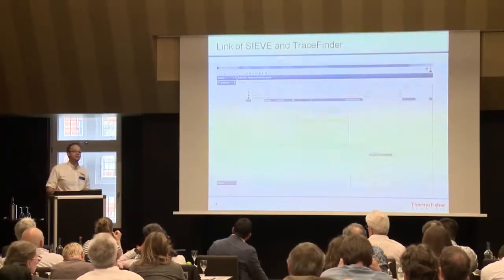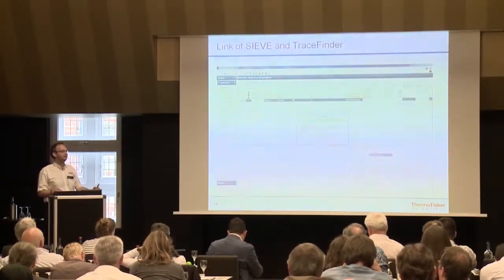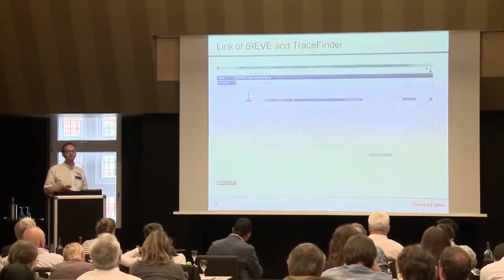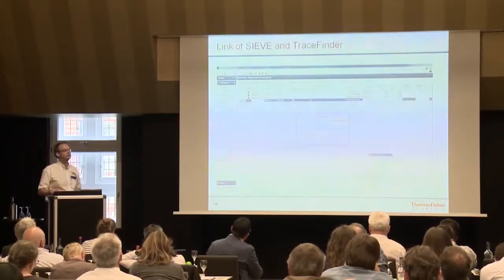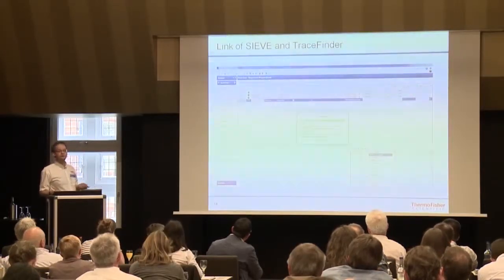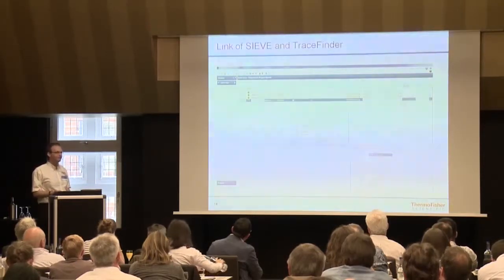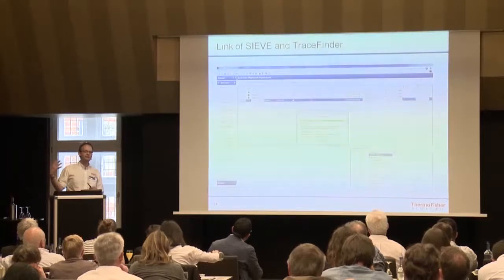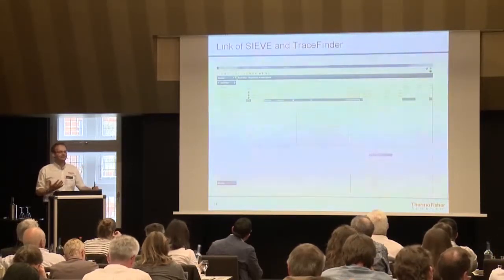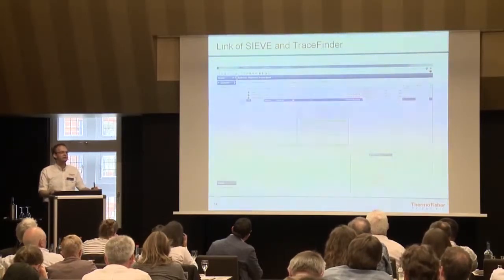Okay, and once you've done that, so you have done your framing, you have done your filtering to filter out what's significant for you, what answers a certain question you may have to these samples, and then you just put it back into TraceFinder. You just close the application, you say import results, and what's happening here, the filtered masses, which are somehow significant with their eventually already done identification, are coming back into TraceFinder, and they will go into a new database.